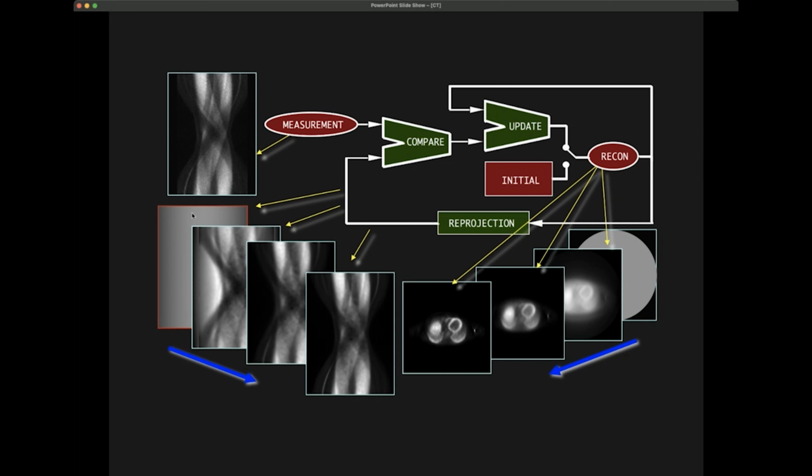Obviously, this is computationally expensive. You need to do a lot of calculations. So this is much more expensive than doing just Fourier transforms, even if you would do interpolation. Because every time you need to do the software scanning, and then you need to do the comparison. But these projections, of course, are relatively expensive to calculate, because you need to calculate the projections from all directions.